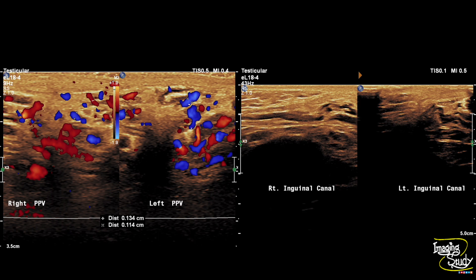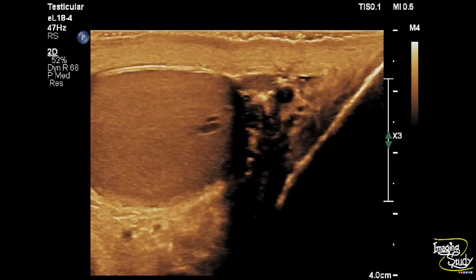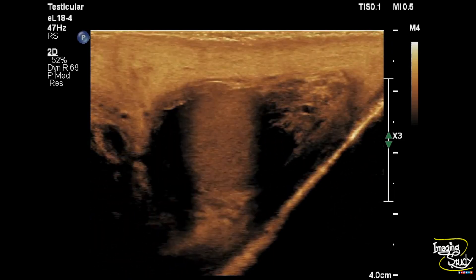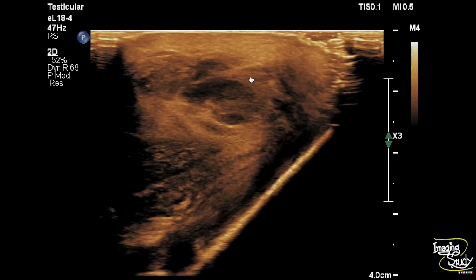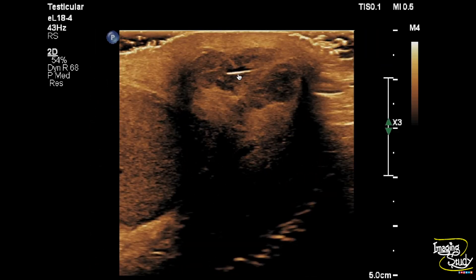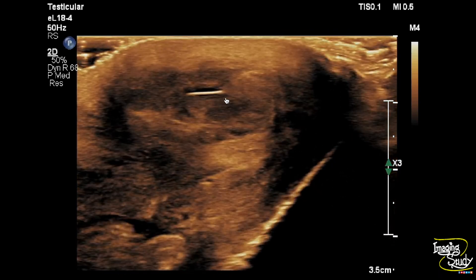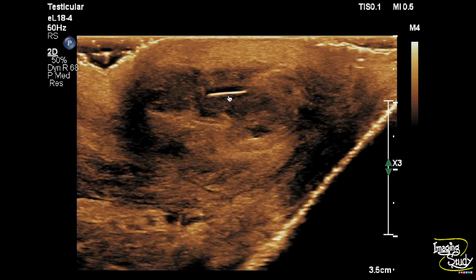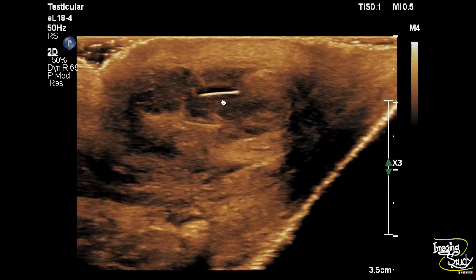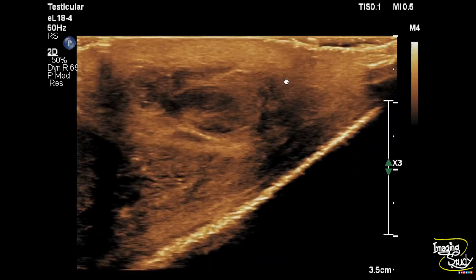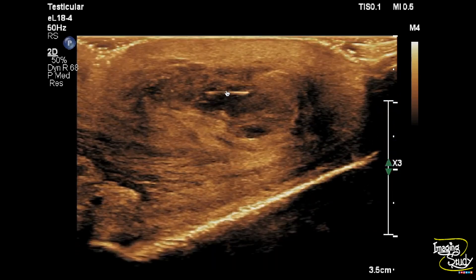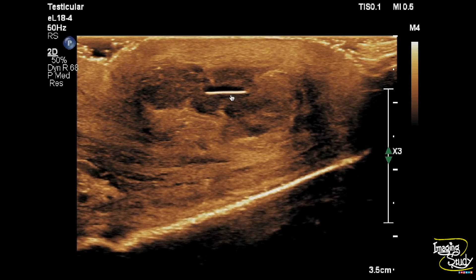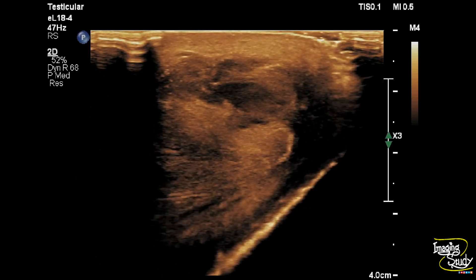Now let's check the bottom of the left hemiscrotum where we have seen the swelling. You can see an irregular hypoechoic area with a central well-outlined linear echogenic focus. This echogenic linear structure is of sharp margin. If you check carefully, there are some reverberation artifacts casting from this structure. The surrounding hypoechoic area is having ill-defined margins. You can see a very thin amount of anechoic collection adjacent to this echogenic focus. So, this structure is a foreign body impacted within the scrotal skin.